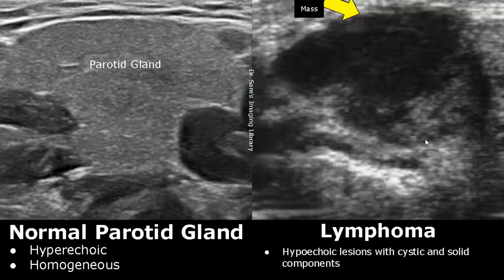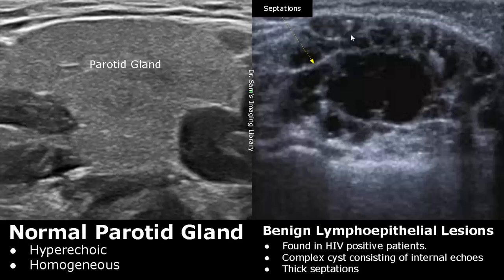Benign lymphoepithelial lesions are usually seen in HIV-positive patients. The parotid gland will contain complex cysts with thick septations and internal echoes. These bright walls within the complex cysts are the septations.